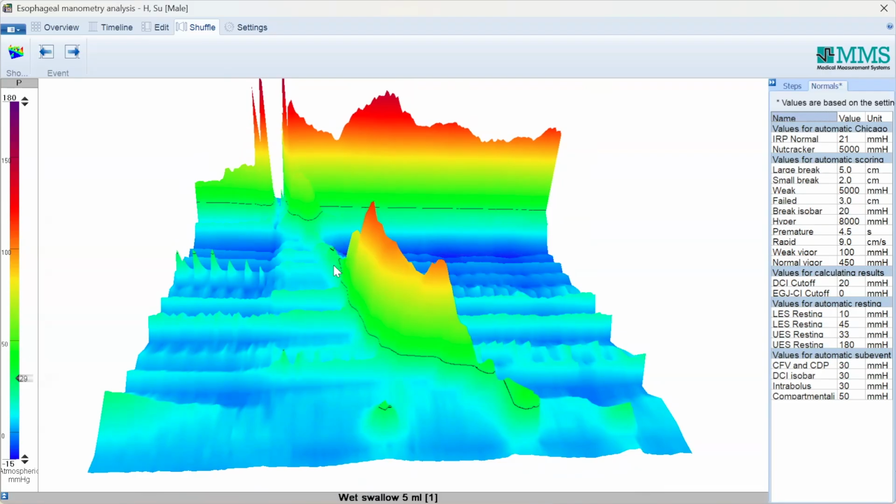We have this X and this X, let's say X, Y, and Z, and we multiply them all together to get the DCI. That's all. So we can say that we are in DCI. It's a number that reflects how high this is.